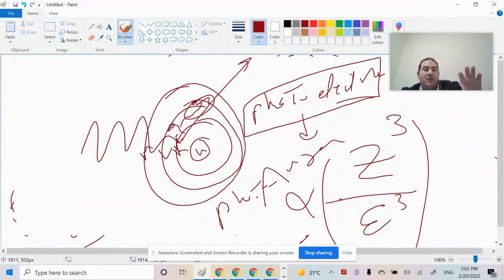With low energy, you find that the ratio of side scatter, which is not in the direction of the film or the receptor, is higher than that in the direction of the film. And with high energy X-ray, you find that forward scattering is higher. The forward scattering here is higher than the side scattering, which is why you will always find that with high energy, the forward scattering is greater in the direction of the film.